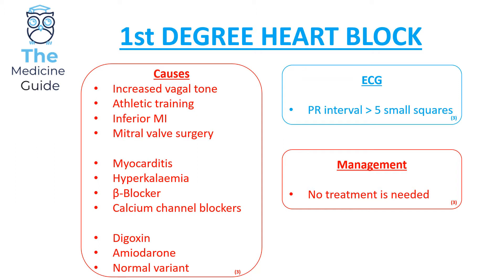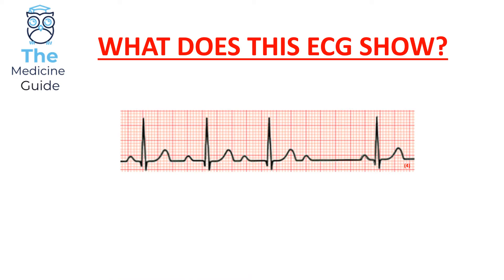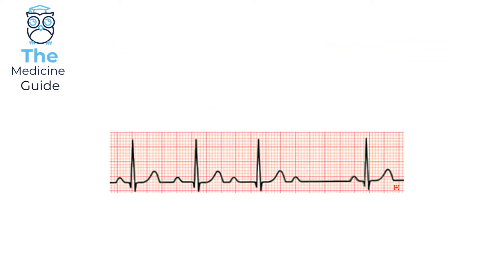Let's have a look at the next ECG. I'll give you 10 seconds to pick out the key features and write down what you think is the underlying heart block. Looking at this ECG, I like to confirm exactly where the P waves are to clarify that this ECG is in sinus rhythm. I also like to confirm exactly where the QRS complexes are, and clarify that each P wave is followed by a QRS complex — but as you can see, that isn't necessarily the case here.